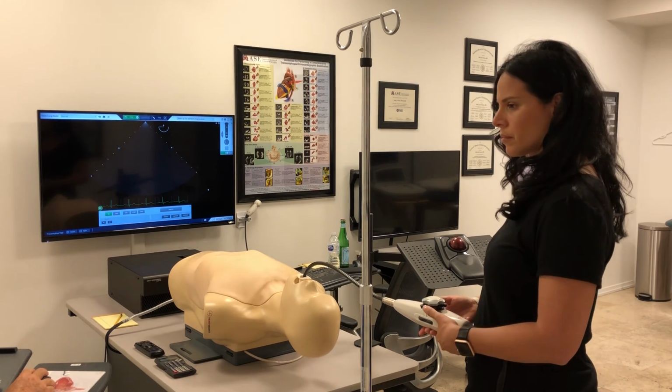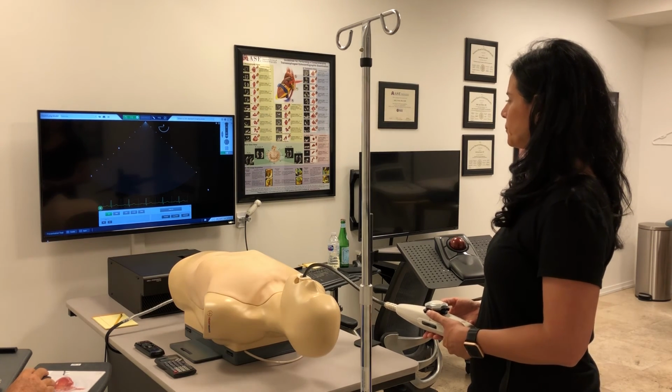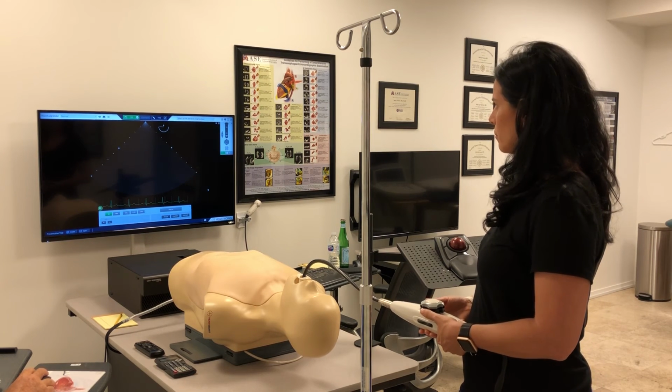So we've gone past the apex of the heart now by exactly 3 centimeters, that distance between your fingers and the bite block when you started to push. Now you have to do a hard anteflexion to look back at the heart. Because you've gone past it, you have to look back at it. So let's bring in a hard anteflexion.